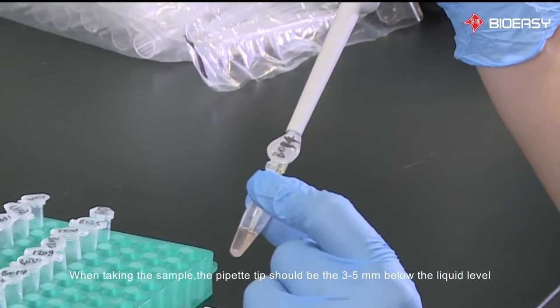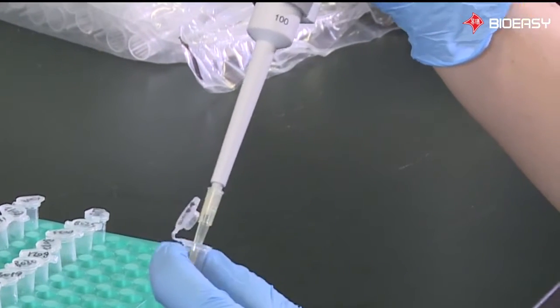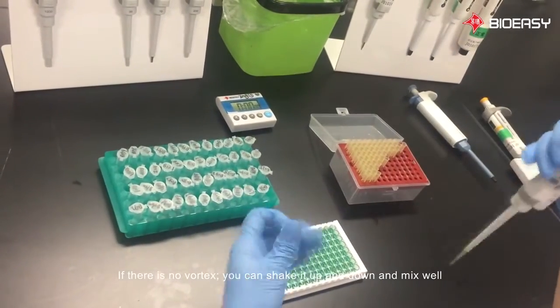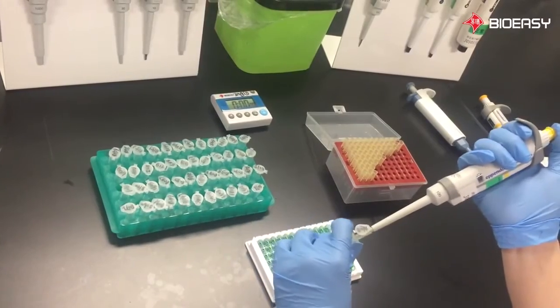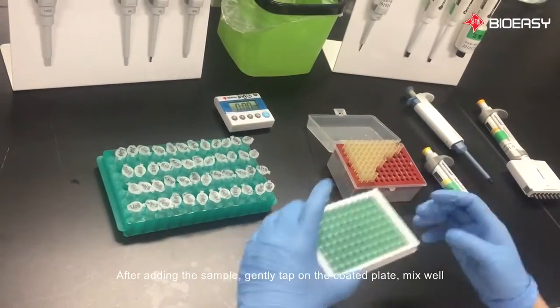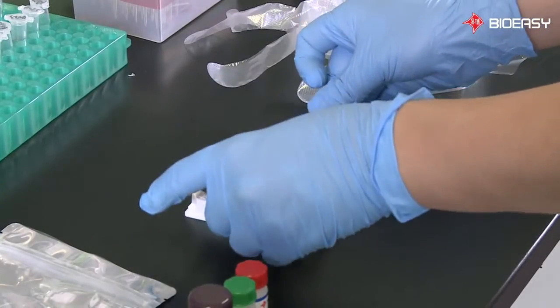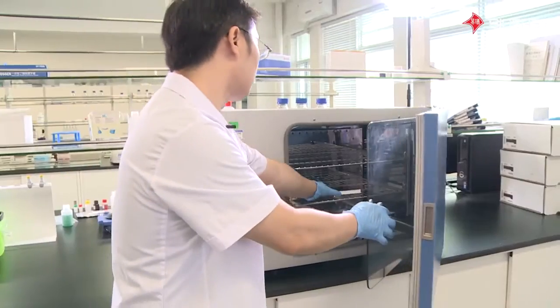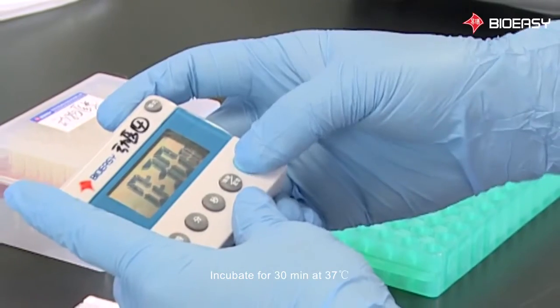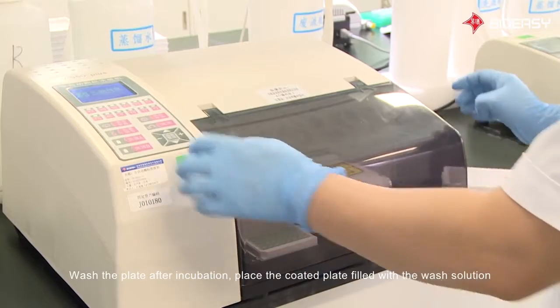When taking the sample, the pipette tip should be three to five millimeters below the liquid level. Do it slowly in order to avoid spilling. If there is no vortex, you can shake it up and down and mix well. After adding the sample, gently tap on the coated plate to mix well.